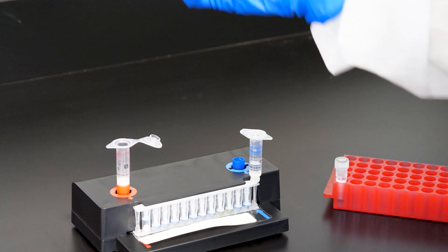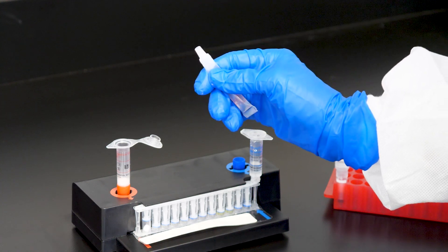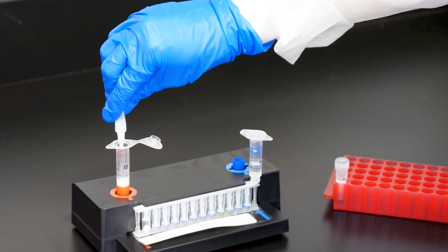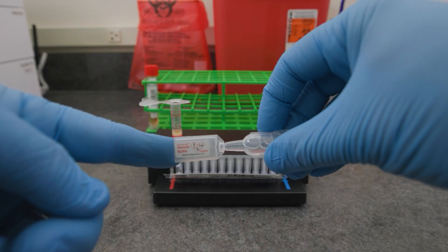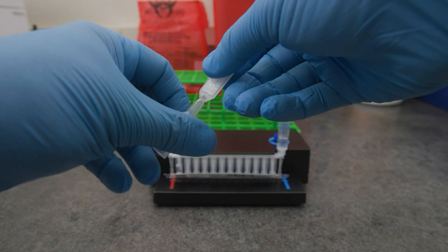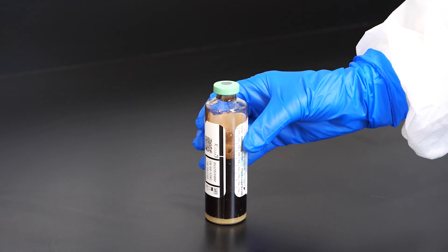To prepare the sample mix, add sample buffer to the sample injection vial. Hold the sample buffer ampule with the tip facing up. Firmly pinch at the textured plastic tab on the side of the ampule until the seal snaps. Invert the ampule and dispense the entire volume of sample buffer into the sample injection vial. Avoid touching the tip of the buffer ampule to the inside of the sample injection vial. The sample buffer vial may also come with a plastic tab on the tip — to open these vials, gently twist and remove the tab at the tip. Thoroughly mix the positive blood culture bottle by inverting it several times.